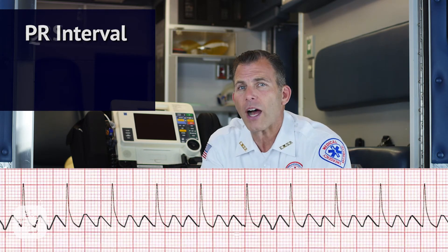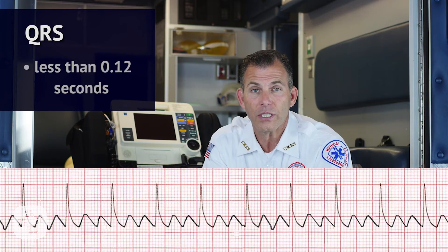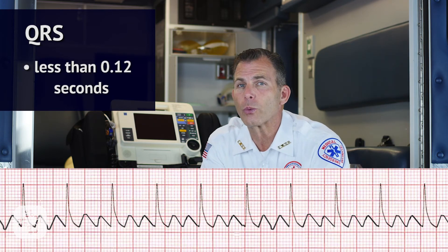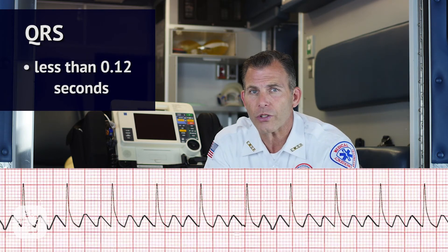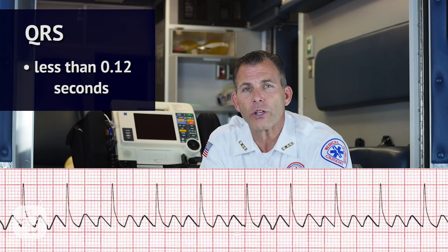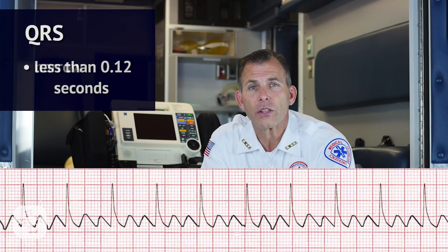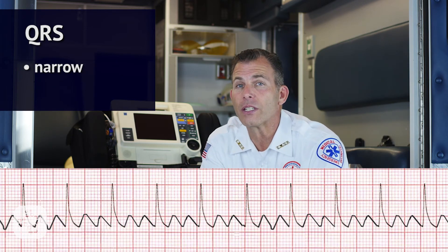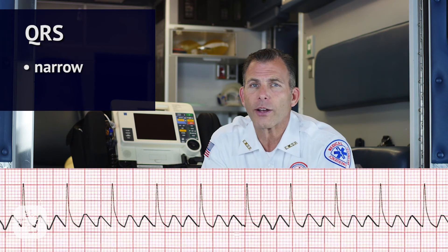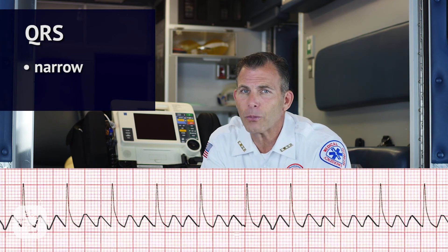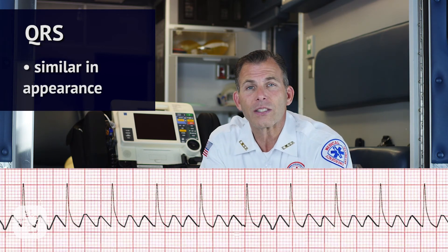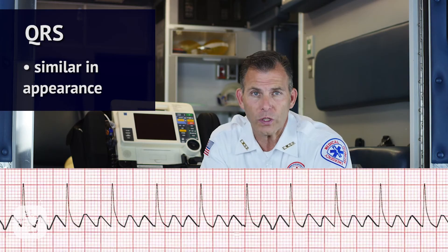Now we move on to the QRS complex of the ECG. Is the QRS interval less than 0.12 seconds? Yes, it is. The QRS is within normal range. Is the QRS wide or narrow? In this case, the QRS is narrow. Are the QRS complexes similar in appearance? We can see here that each one does look similar.